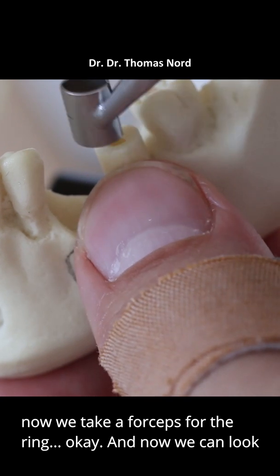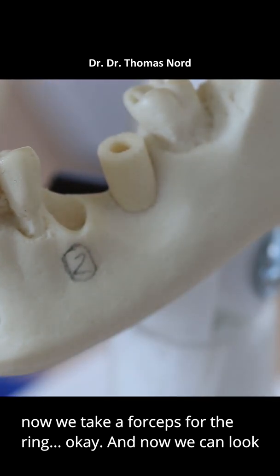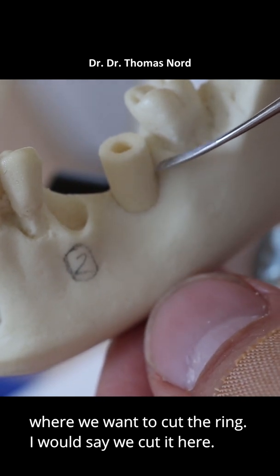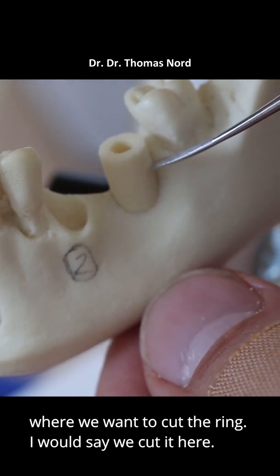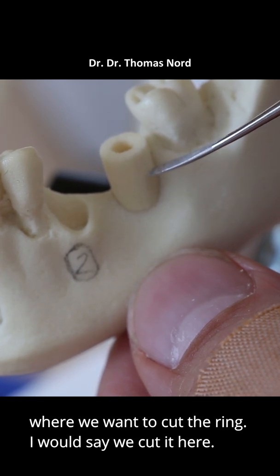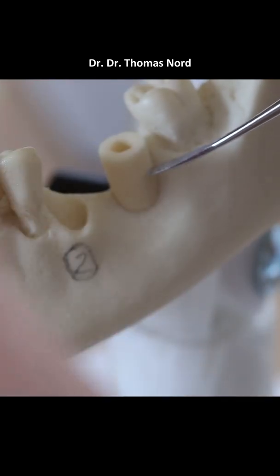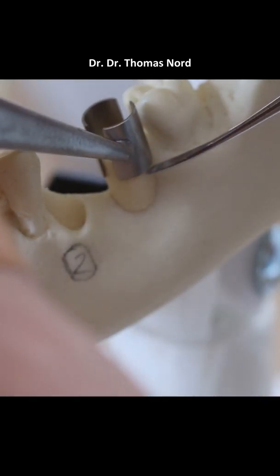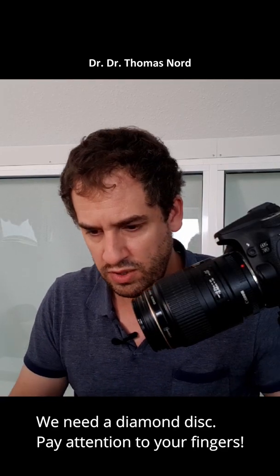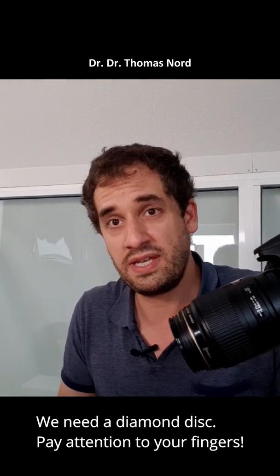Now we take the forcep for the ring. We can look where we want to cut the ring — I would say we should cut it here. It's about 5mm. We need the diamond disc. Pay attention to your fingers.